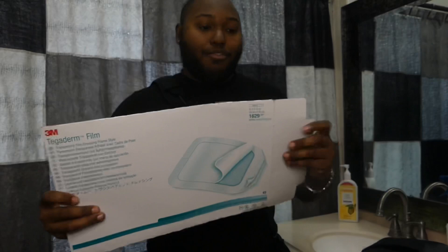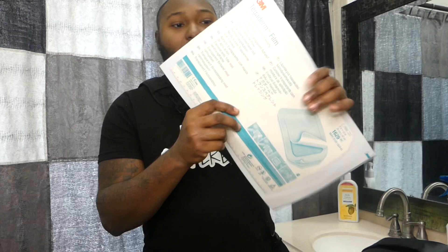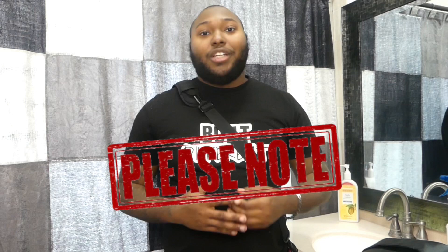The next step is the 3M Tegaderm film dressing. This dressing is fairly large — it's one sheet — so what I normally do is cut it in the middle at the bottom measurement line so I can split it in half. With that half piece I cover the dressing site, and then you are ready to take your shower.